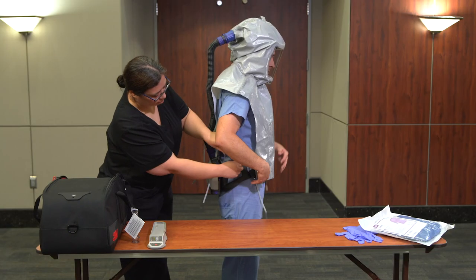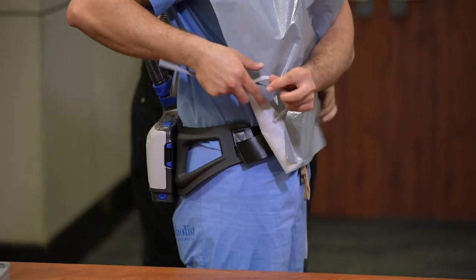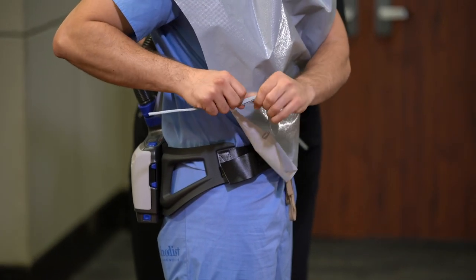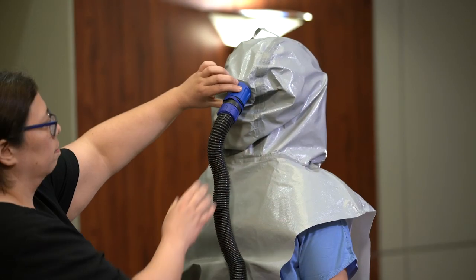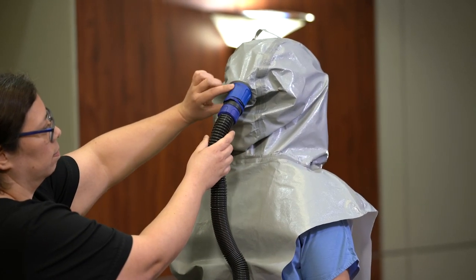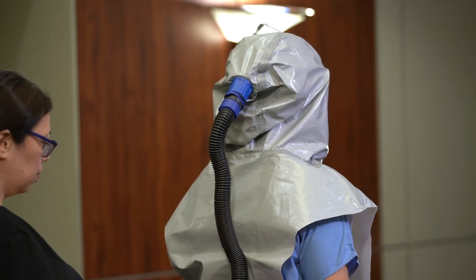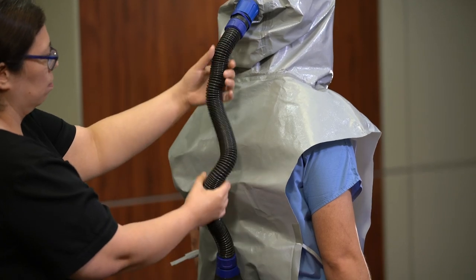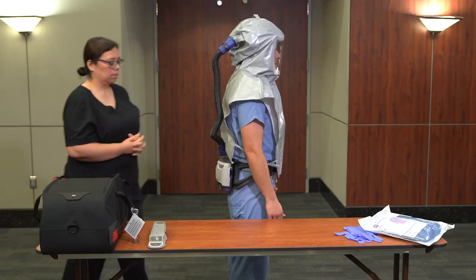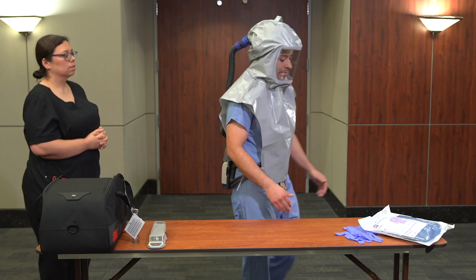The outer shroud has ties on each side of the caregiver's body. Ensure that the ties are tied securely but loose enough to allow movement. Ensure proper airflow is delivered through the head cover. The head cover has a dial at the back of the device; adjust the airflow to ensure comfort for the wearer. If fogging occurs, increase fan speed on the PAPR. Confirm the hose is connected and has no kinks, leaks, or obstructions.